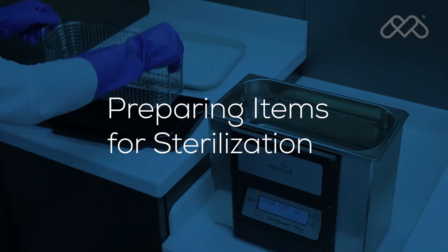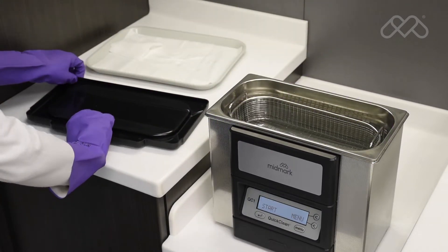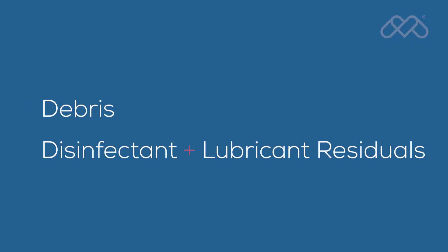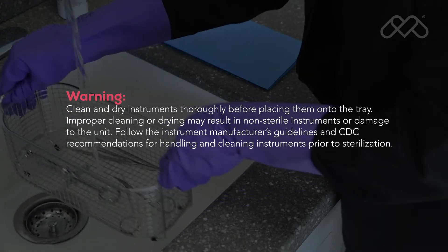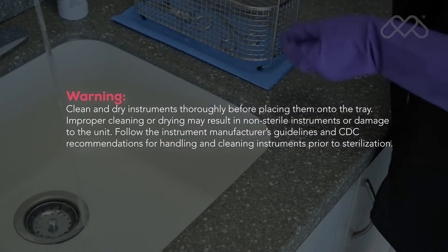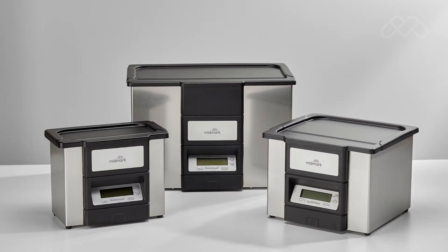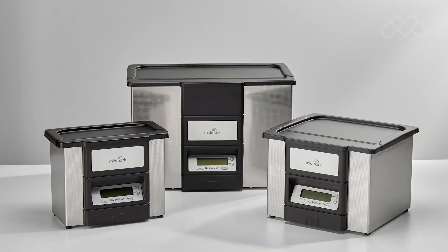Clean instruments immediately after use to avoid drying of residual matter. Instruments must be thoroughly cleaned to remove all residual matter, such as debris, disinfectant and lubricant residuals, blood, and organic matter. The use of automated cleaning equipment, such as an ultrasonic cleaner or washer disinfector, is recommended over manual cleaning for clinician safety and cleaning effectiveness.